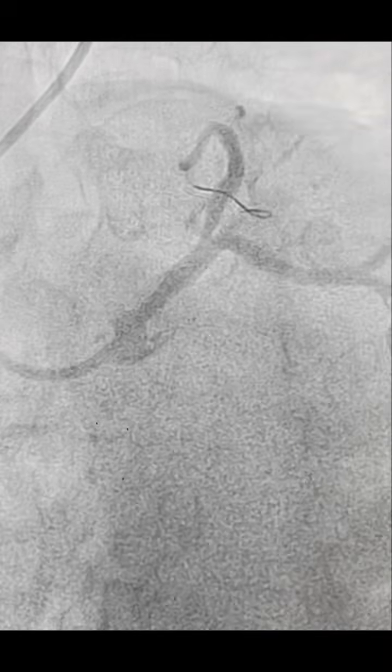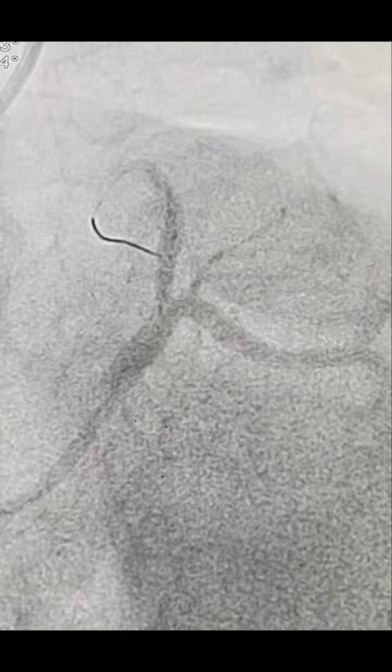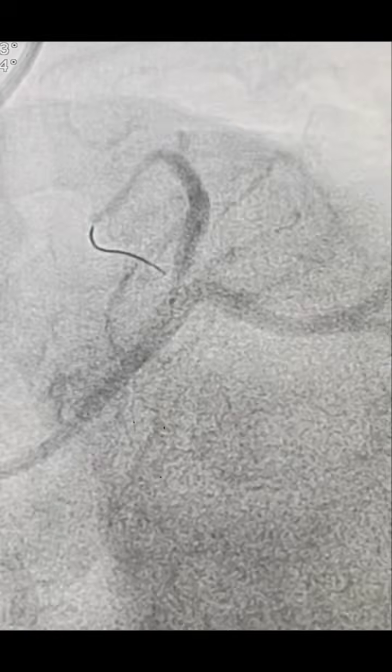Now we proceeded to the ostioproximal LAD. This was the positioning of the stent. It is very difficult to put the ostioproximal stent in the LAD, that too in a thrombotic occlusion. So I kept 1 or 2 struts in the LM. That is, I wanted to do the nail the ostium technique, and the stent was deployed at around 14 atmospheric pressure. This was a 3.5 into 13 stent.